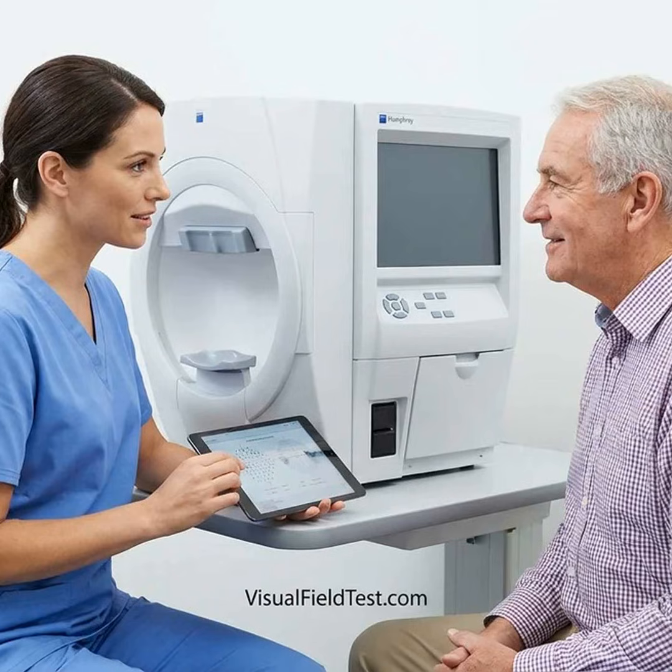When extra coaching is especially important, ask for additional instruction or a supervised practice session if this is your first visual field test, you have had one or more unreliable results, you feel intense anxiety about failing the test, you have difficulty hearing or understanding spoken instructions, you have memory, attention, or neurological problems, you have a drooping eyelid or difficulty keeping your head still, you become tired during the second eye, or your home test results are repeatedly inconsistent with clinic results.